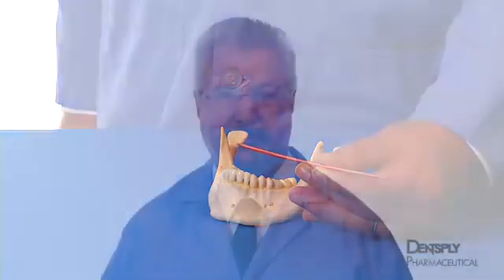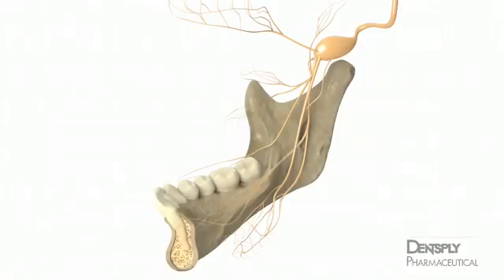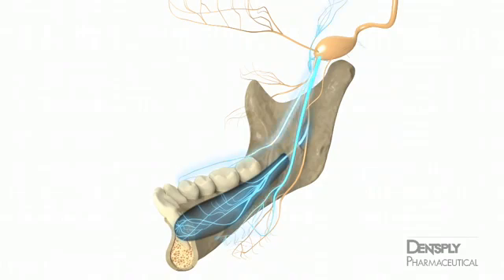The target for the Gowgates injection is the neck of the condyle, just below the insertion of the lateral pterygoid muscle. In contrast to other intraoral nerve block techniques, this point is at least 1 centimeter away from the nerves of interest. Therefore, medial, anterior, and inferior distribution of the anesthetic agent within the pterygomandibular space is essential for anesthesia to occur. The Gowgates injection is the closest intraoral technique to a true mandibular block. In addition to the inferior alveolar and lingual nerves, the buccal and auriculotemporal nerves are often blocked, the buccal nerve approximately 70% of the time.